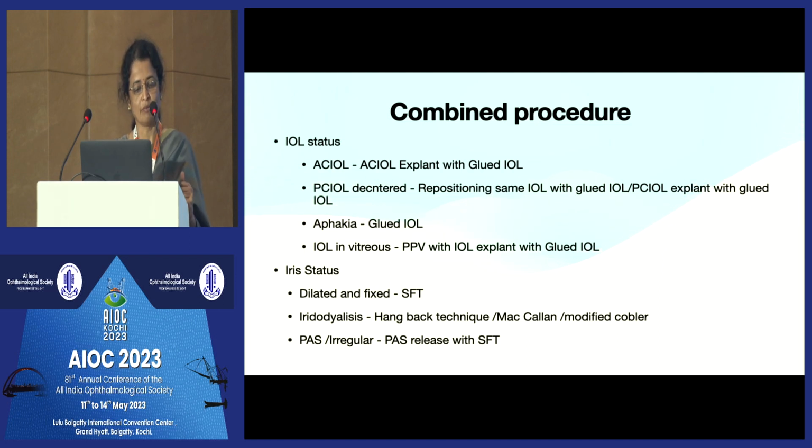Iris is very important because, believe me, if something has to go wrong for a surgeon on the table, it can go wrong in all situations. Sometimes you have a PCR with iris coming out. You can accidentally have an iridodialysis, or with your phaco probe the iris tissue can be pulled away here and there.